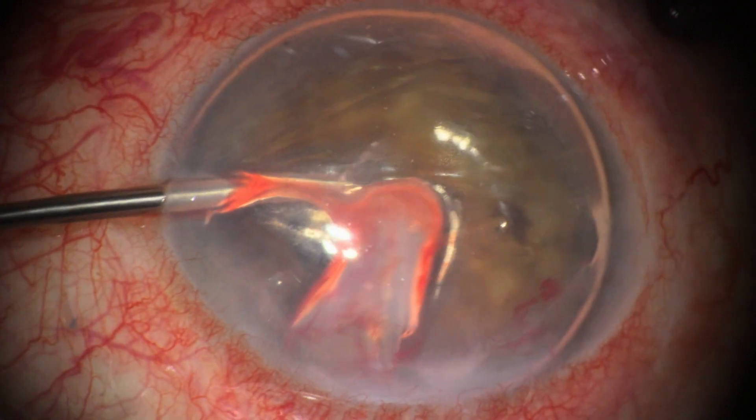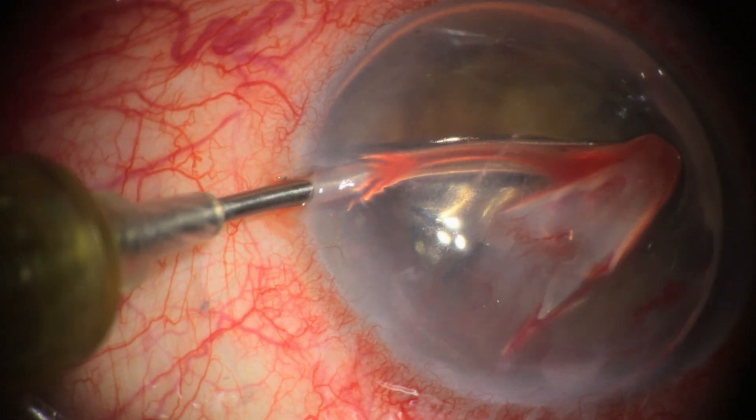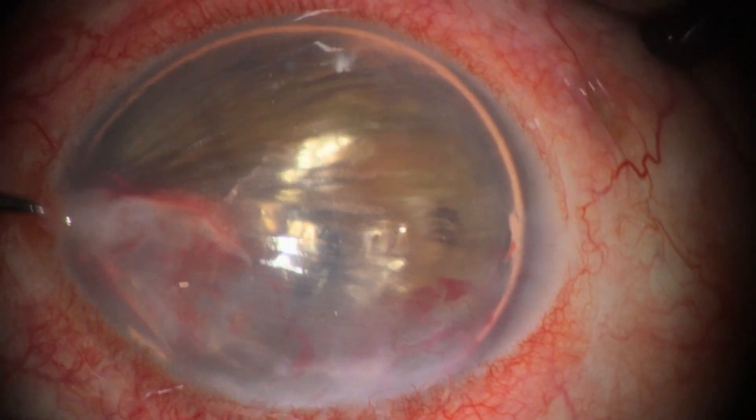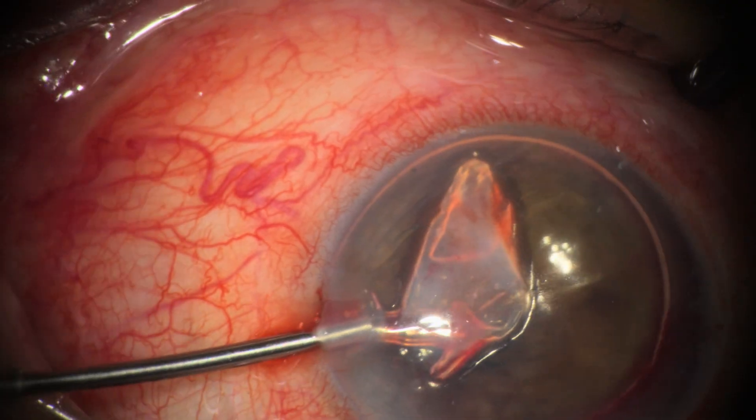We've now stripped the membrane off the entire posterior surface of the cornea and up to the main wound. We're enlarging one of the paracenteses to allow for complete removal of the membrane.